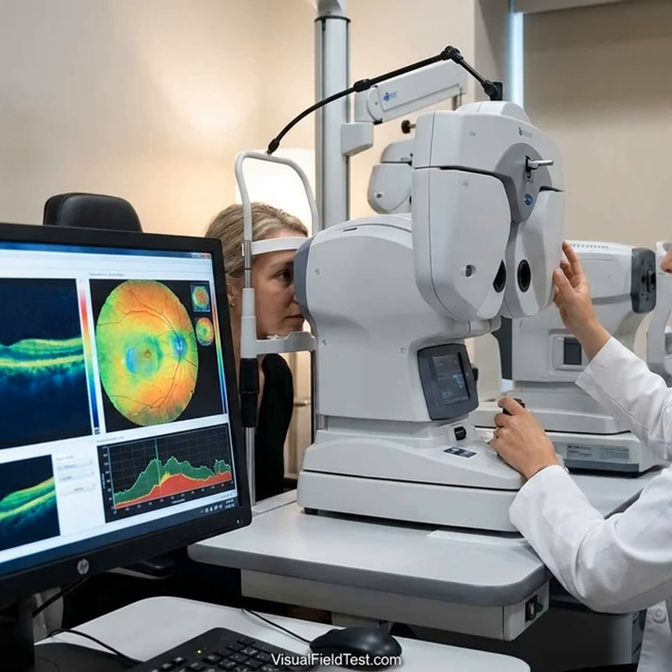In advanced glaucoma, stage 3 to 4, where visual fields show large defects or only small islands of sight remain, OCT has important limitations and some remaining uses. The biggest issue is the floor effect. By advanced stages, the RNFL often thins down near the device's measurement limit. Most OCT machines can only measure RNFL thickness down to roughly 40 to 50 microns.